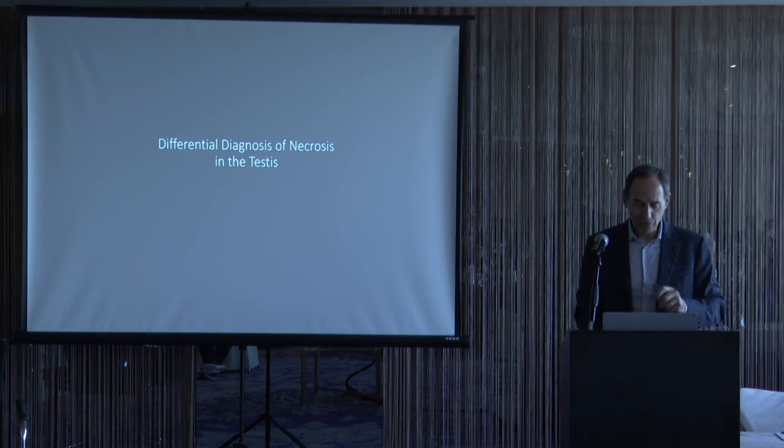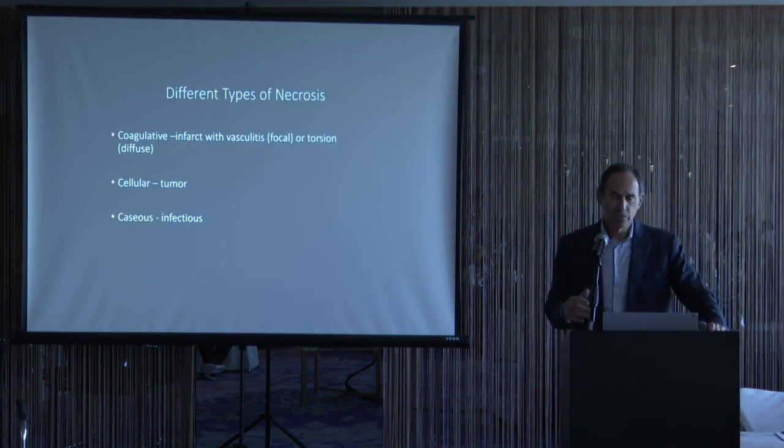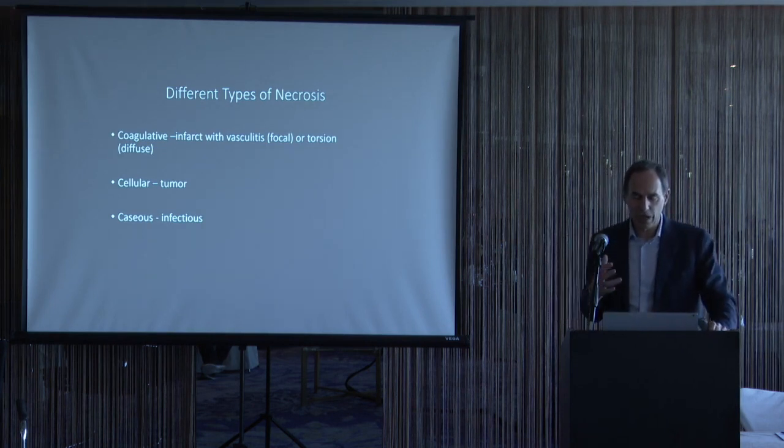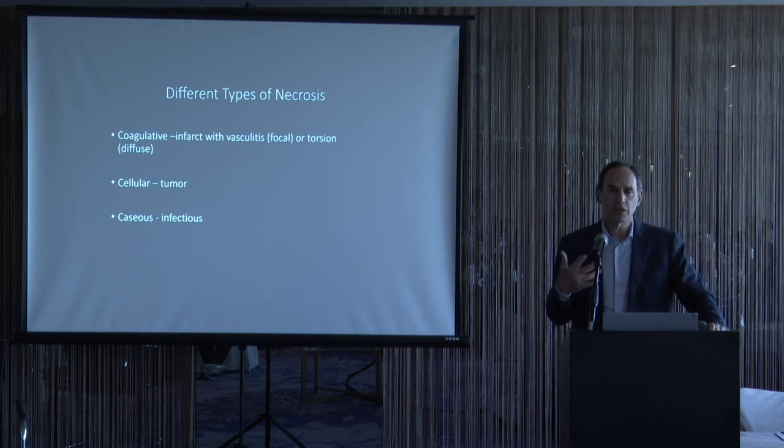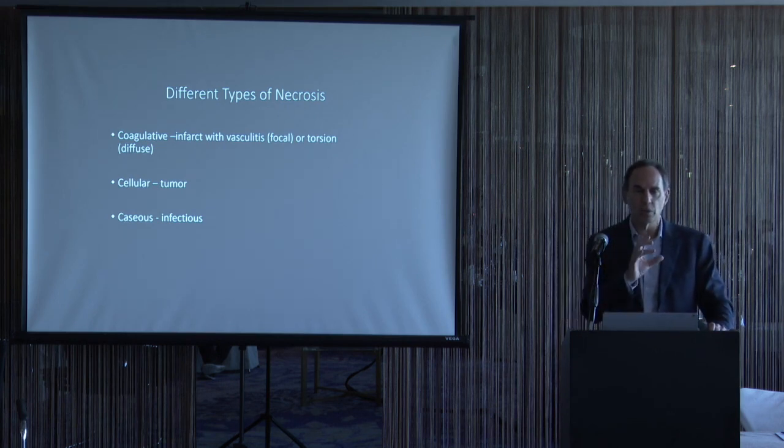So let me now turn to differential diagnosis of necrosis in testes. As I mentioned yesterday with one of the slide seminar cases, it's important whenever you have necrosis to say what type of necrosis it is. Is it coagulative necrosis, an infarct? As we'll see, the common scenario that you see that in the testis is either going to be vasculitis or with torsion. And the difference is that if you have vasculitis, the infarct will be focal in the testis.